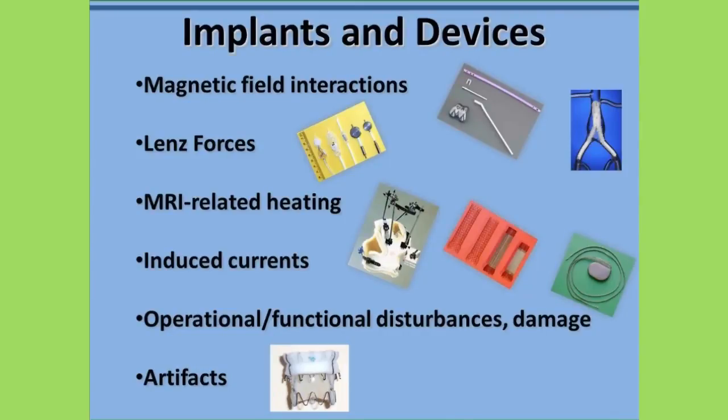Additionally, there are lenz forces, which is when an object that is non-ferromagnetic but made from conducting materials moves through a magnetic field, resulting in forces that may be felt by the patient. This is important to remember for patients with large non-ferromagnetic implants, such as total knee or hip replacements, because these patients may feel tugging or pulling on the implant as they are being moved into and out of the bore of the scanner. By slowly moving patients with large implants into and out of the MR system, issues related to lenz forces can be prevented.